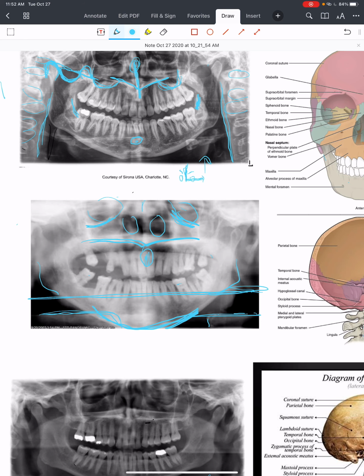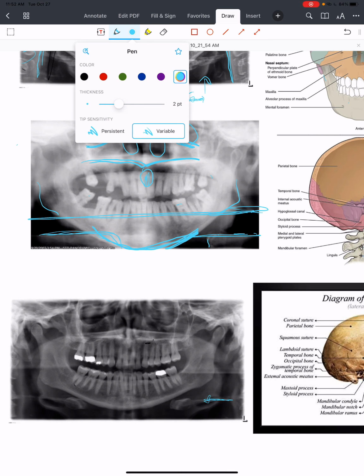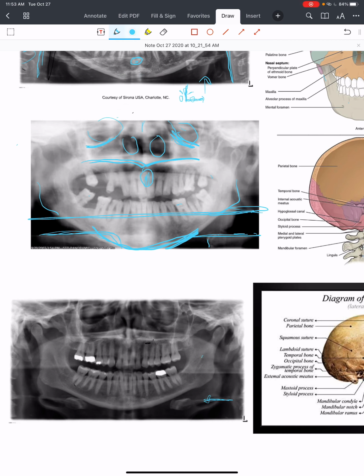Next, I'm going to be talking about image number 3. First, I really like this image because we can see this structure, which has two radiopaque outlines, and it comes out to this radiolucent structure. This is known as the mandibular canal or the inferior alveolar canal, and it appears as a radiolucent tube-like structure, like I said, with two radiopaque parallel lines.